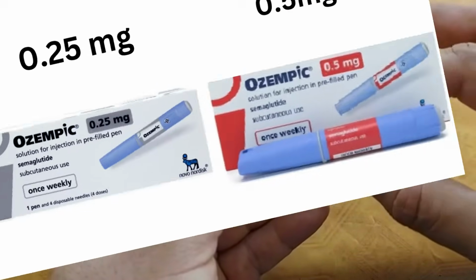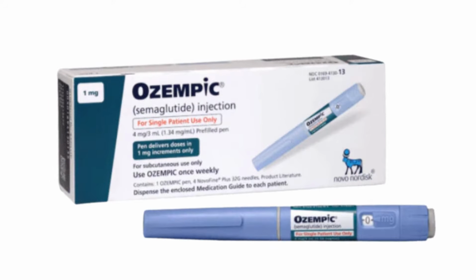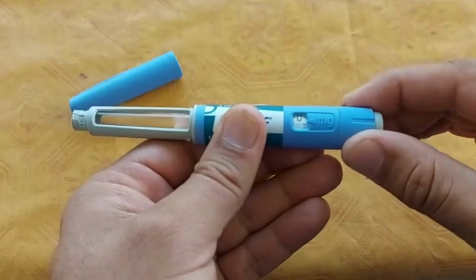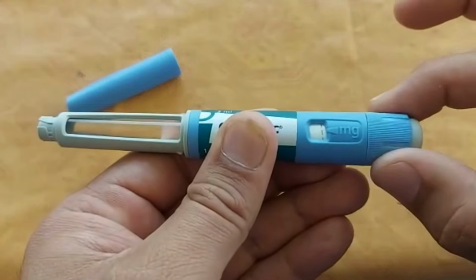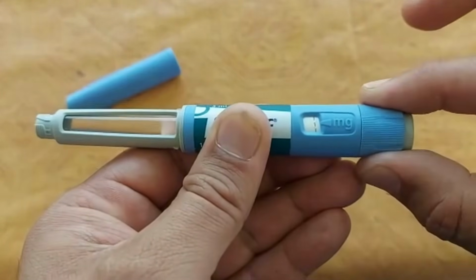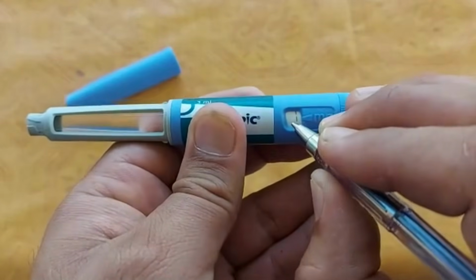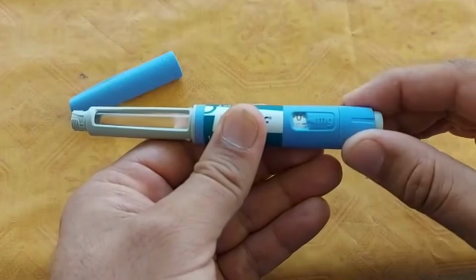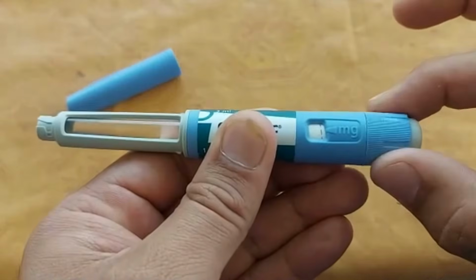Now let's explore how to take smaller doses like 0.25 milligrams or 0.5 milligrams from the Ozempic 1 mg pen. For a 0.25 milligrams Ozempic dose, start counting from the first click sound or point 0. Count up to 18 clicks and mark that point. Remember that these 18 clicks are equal to your 0.25 milligrams Ozempic dose. When taking your weekly dose of 0.25 milligrams, start from 0 and rotate the dose selector to 18 clicks.